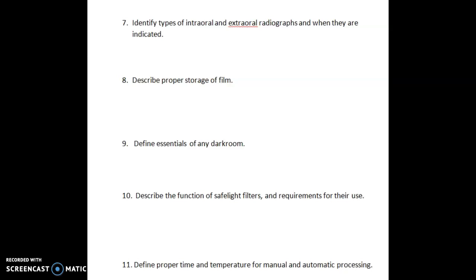But there are times, if you've got a periodontally involved patient with a significant amount of bone loss, you would actually take a vertical bite wing, meaning that the film or the sensor would be standing up vertically to allow you to see a taller view. You would get more bone on either side of the maxillary or mandibular if they had that bone loss. But like I said, the most common is the horizontal posterior bite wing. So just keep that in mind.